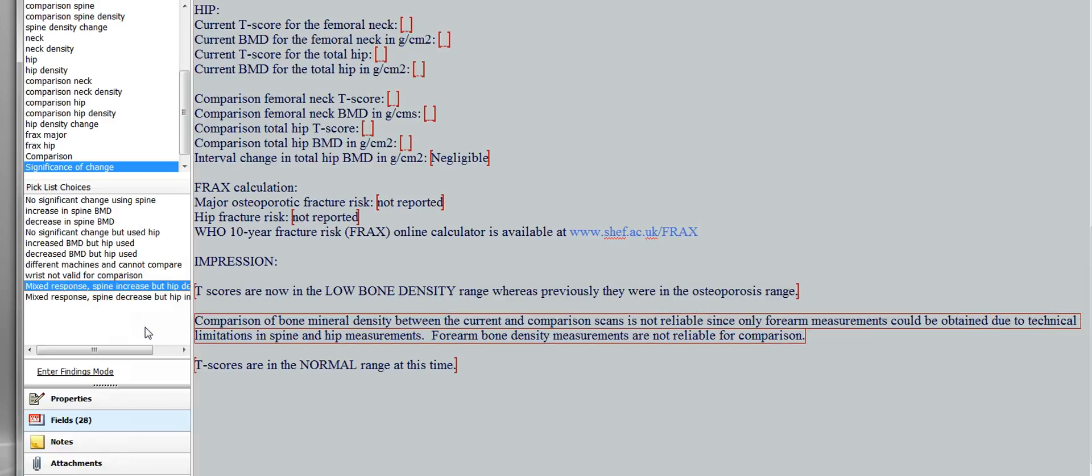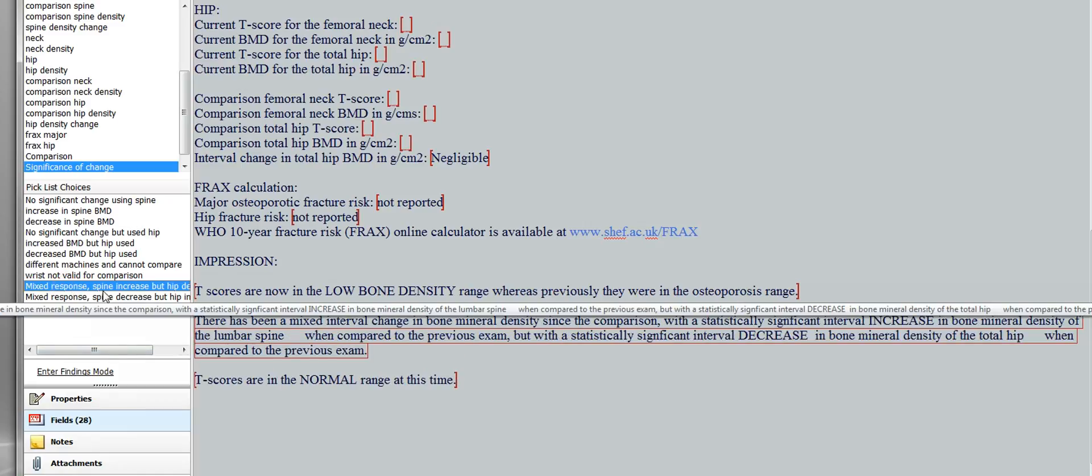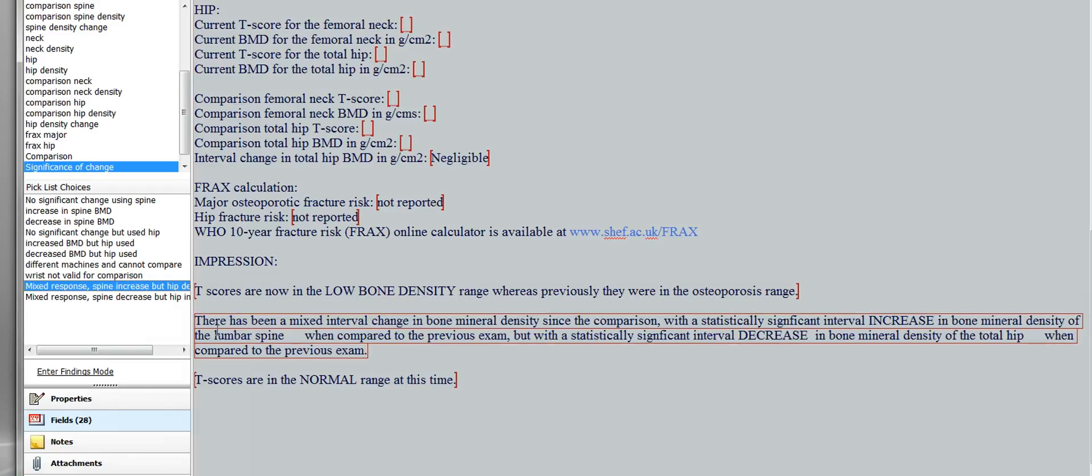So if you want to do that, you double click the mixed response, and let's say the spine increased, hip decreased, you would click this one. And then you're going to get, there has been a mixed interval change in bone mineral density since the comparison with a statistically significant interval increase in bone mineral density of the lumbar spine.